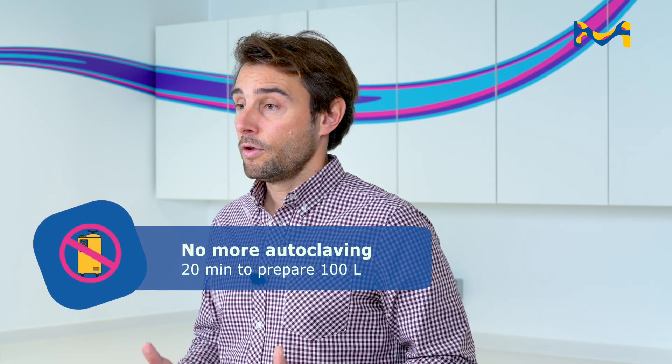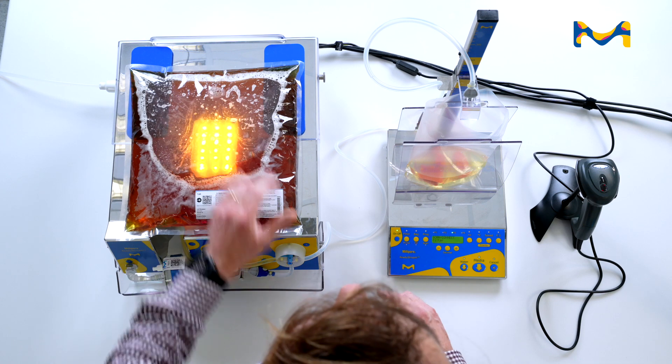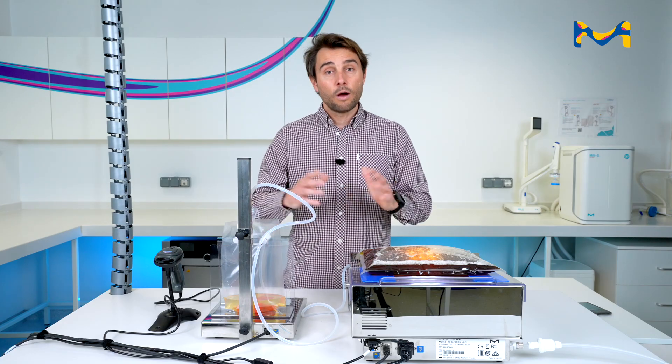Second feature: you don't need to autoclave your media. Everything is done with filtration and a gamma irradiated media. So at the end, you have a sterile media without any autoclave, which saves you a lot of time because you can prepare up to 100 liters of culture media in less than 20 minutes.